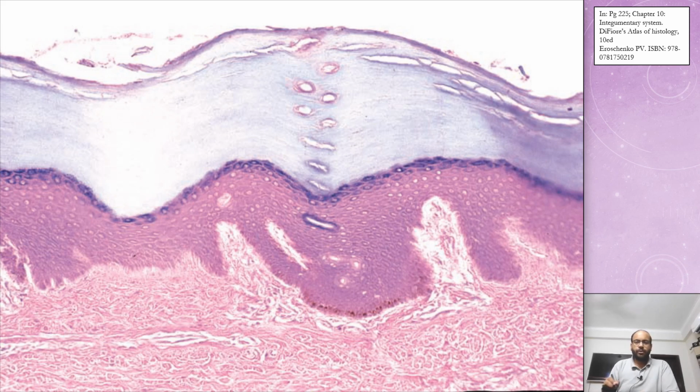In this photomicrograph, this histopathology picture, you can see all the layers of the epidermis. You can see a very thickened stratum corneum. The slightly refractile or blurry layer that you can see is the stratum lucidum, a very thin layer. The blue colored basophilic layer is the stratum granulosum. The layers in between, which have a little bit of white dots, are the stratum spinosum.